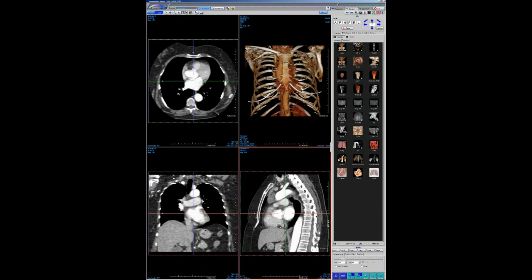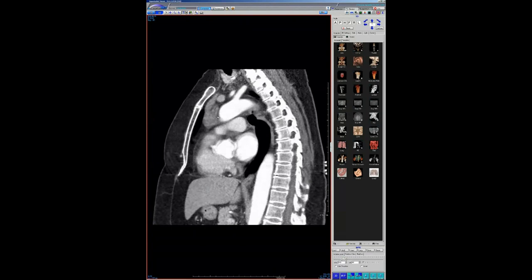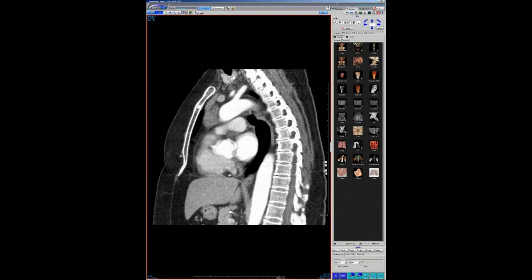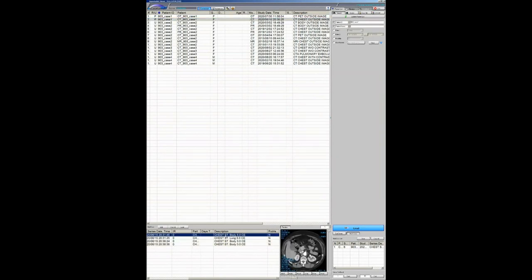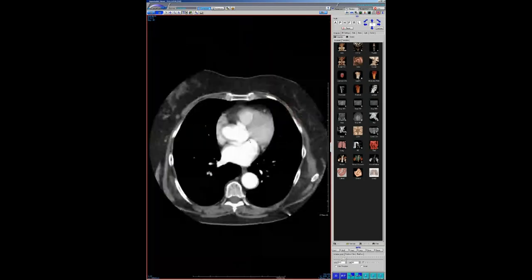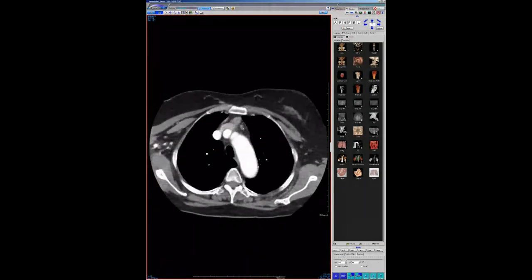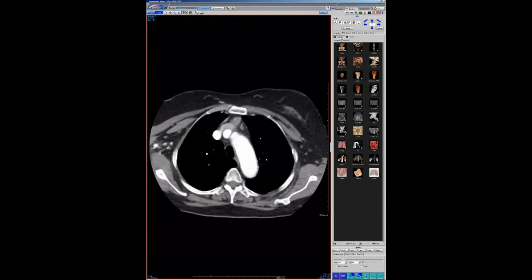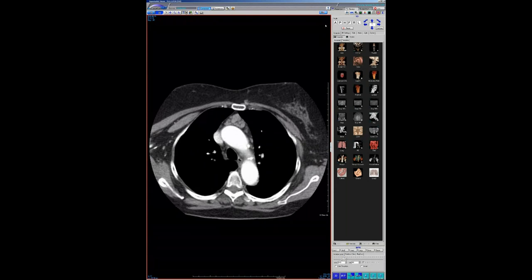So this is just a nice example of a pretty case, but it's a pretty example of a lot of stuff that happens on the outside that can lead to badness. Here's this patient that comes in — she's an older patient — and we can see this very fluffy anterior mediastinal soft tissue. It's interspersed with fat. You also know it's an outside study when all you get is five-millimeter thick slices. You can see this is clearly some sort of hyperplastic thymic tissue. There's no abnormal mass here. It's just thymus.